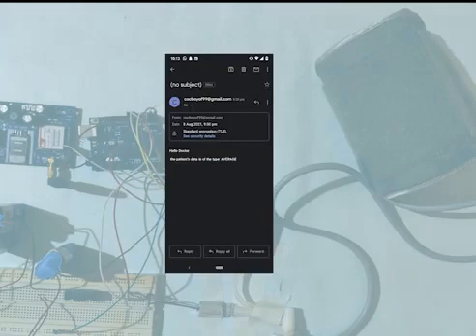cocboy99 at gmail.com is the email ID the Python script is using to send the emails. The email gives a brief information to the doctor about the patient's BP condition, thereby reducing the doctor's workload of personally going and checking the patient's BP condition.